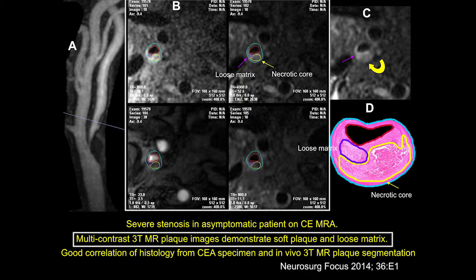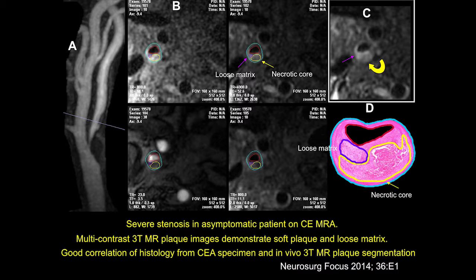Where the magic is some of the multiple software packages that are available that allow you in research mode to do a pixel by pixel analysis and predict what the various plaque components are. What I've done here is taken the markings off of the T2, and this large area that's dark on T2 was the non-hemorrhagic necrotic core.